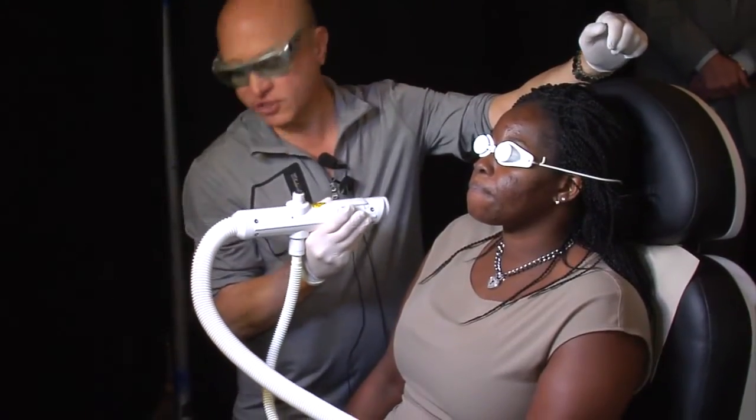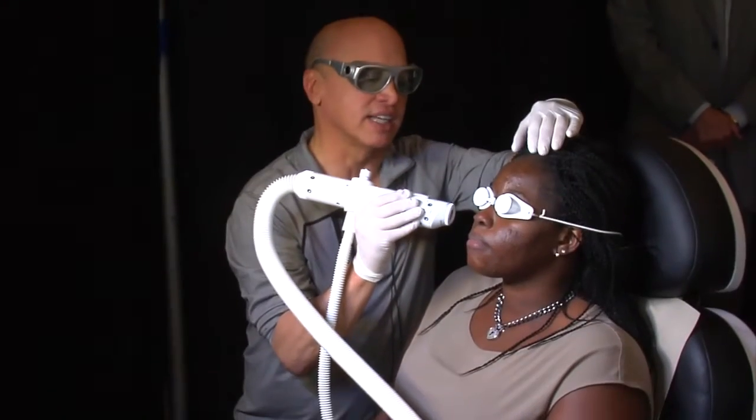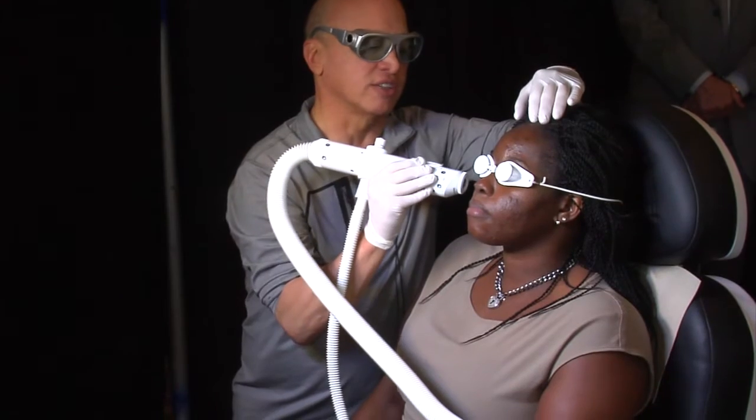Is the trigger on the foot pedal or a hand piece? No, it's a foot pedal — I have a foot pedal by my foot. Now I'm going to hit some isolated areas, and here's where I stack a little bit.